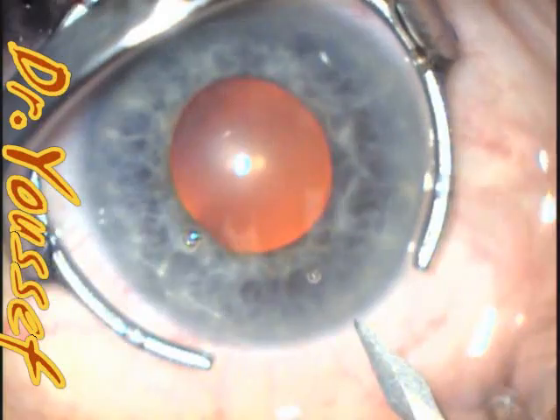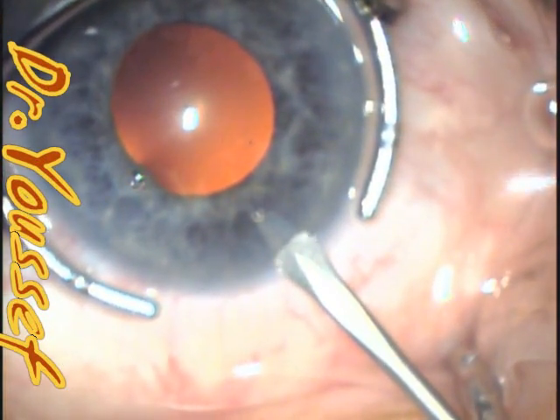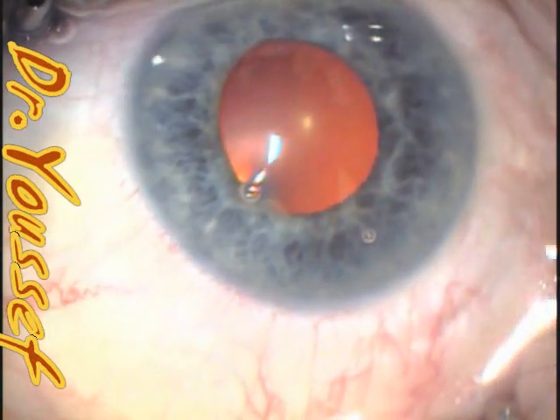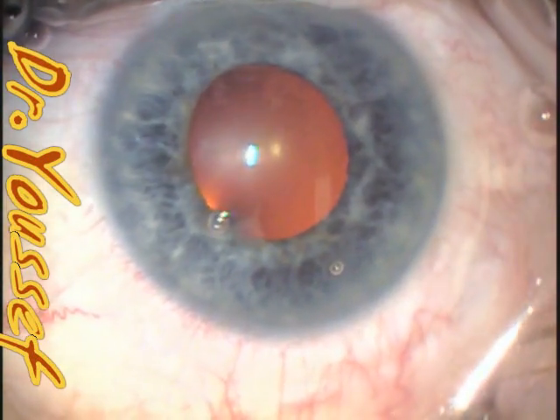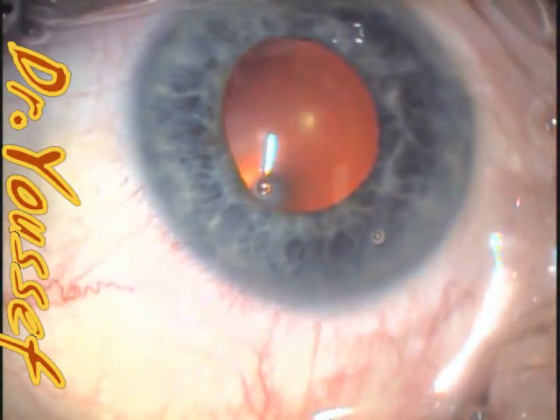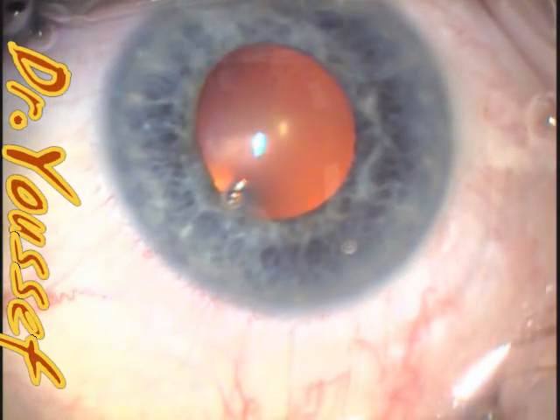The trick here is not to over-inflate the chamber, because otherwise you're going to be pushing the iris against the lens and you'll have a hard time passing the posterior edge of the ring behind the pupil. Do not over-inflate the chamber and try to put some of the viscoelastic underneath the edge of the pupil, especially the nasal part.